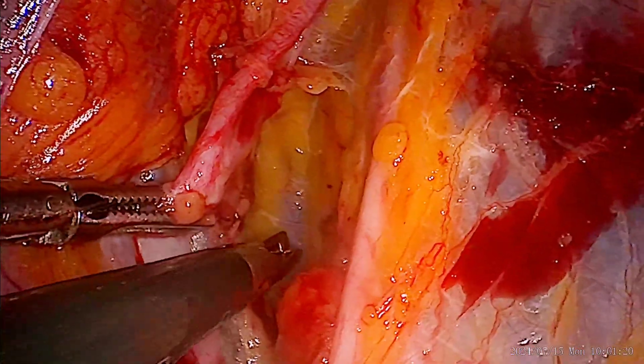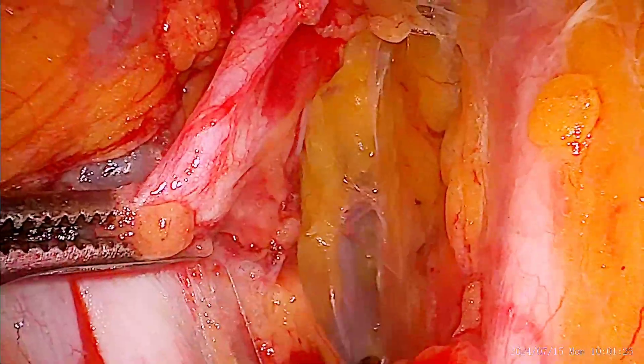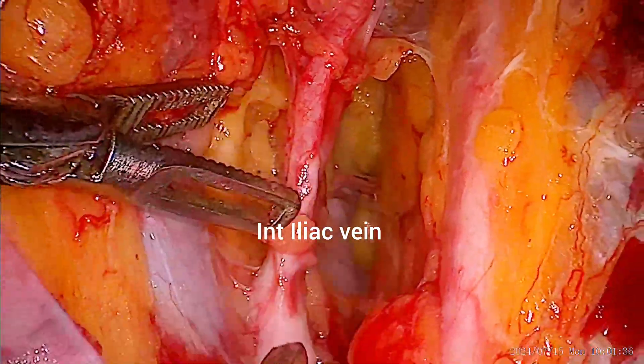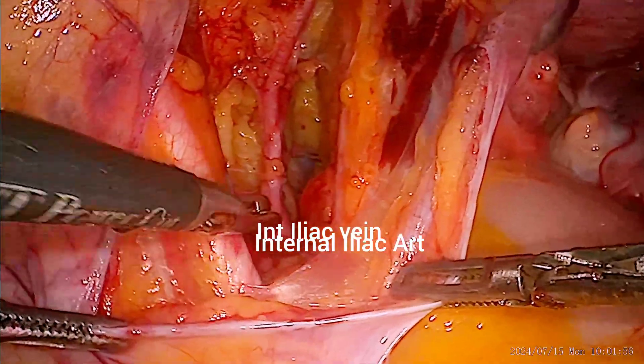Below the internal iliac artery, if you dissect and go between the internal iliac artery and the ureter, you will see the internal iliac vein over there.